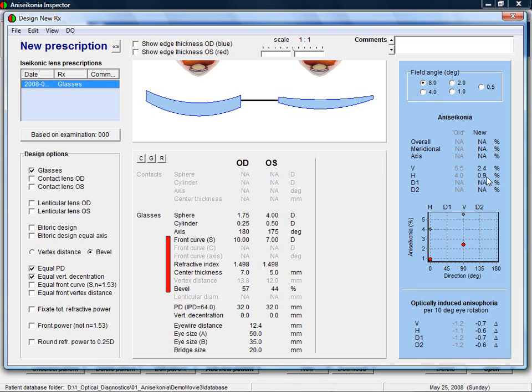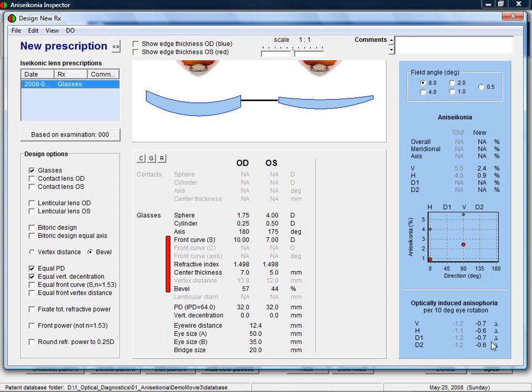For anisometropic patients, like in this case, it is also good to check the possibilities of using 1 or 2 contact lenses. Not only can this lead to cosmetically more attractive solutions, but also the amount of optically induced aniseikonia may reduce more. The amount of aniseikonia is shown here.